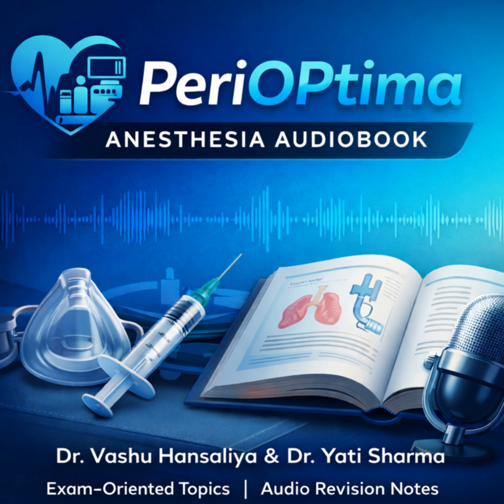We've covered the systems and the errors. Let's now integrate this all under the umbrella of patient safety. How do all these failures converge? They all converge on one final common pathway: hypoxemia. Whether it's a gas supply failure from the MGPS or too much resistance from a blocked scavenging interface, the end result is a threat to oxygenation.